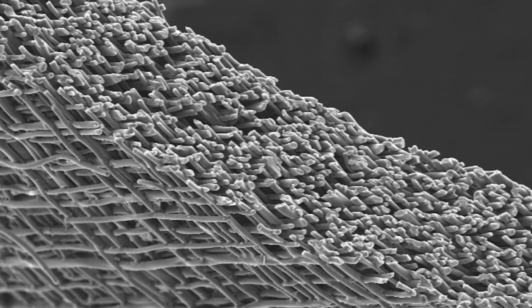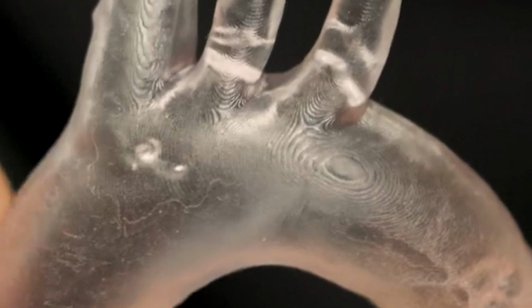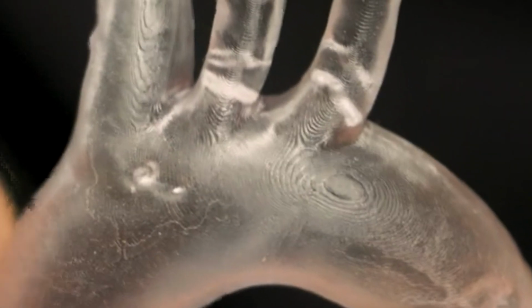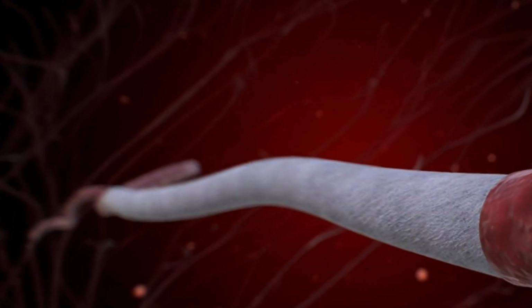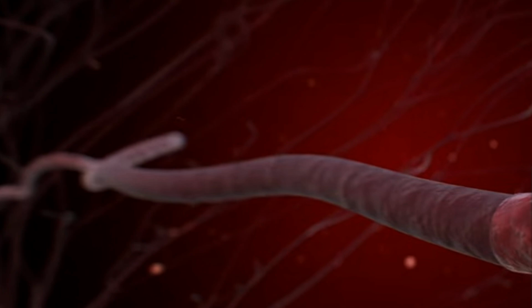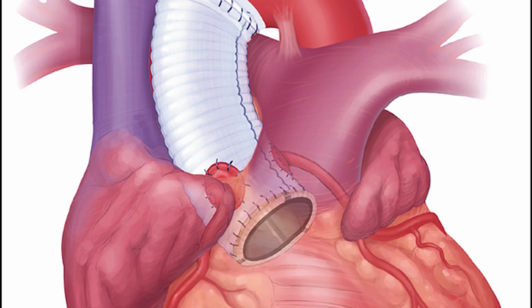You can pull on it, it will expand, but the minute the force goes away, it will go back to the original shape because it is tied down by these knots. Not only does this material expand and contract as the blood flows through it, it also degrades in about 12 months as the new blood vessels regenerate in its place. So we don't have to worry about foreign material staying in the body forever, which causes inflammation, a risk of thrombus or clot formation, and this mechanical mismatch that causes all these problems.